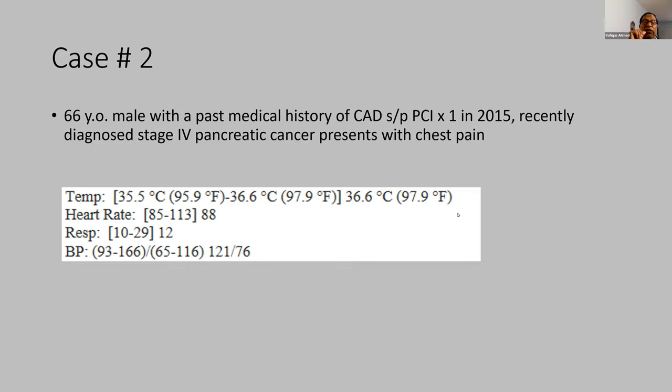Well, this is the way it is. If somebody's HV interval is a properly done HV interval is over 100, you can put a pacemaker in, because these patients are going to be the highest risk. If it is between 70 and 100, then you depend on the symptom. So if somebody comes with syncope, HV interval of 75, I will put a pacemaker in. Left bundle branch block, syncope, 70, but over 100, it's basically an accepted indication for permanent pacemaker.